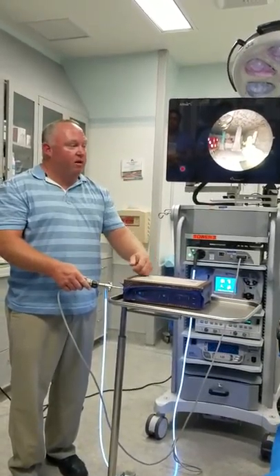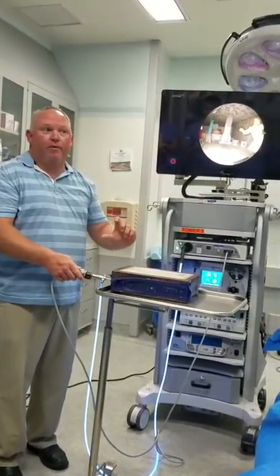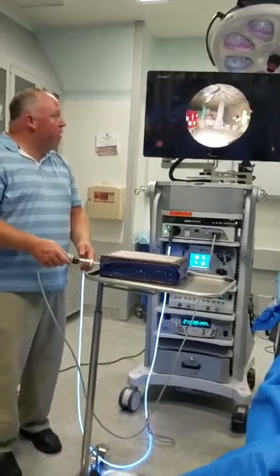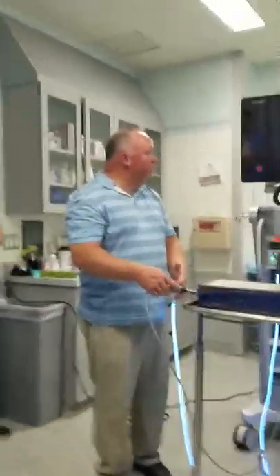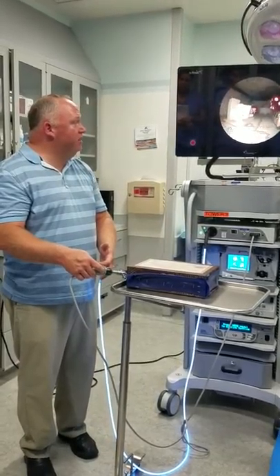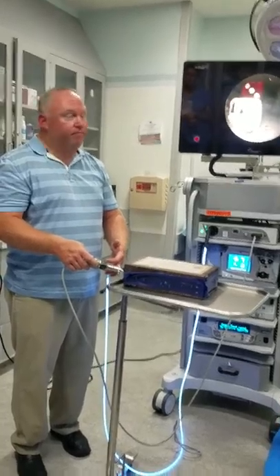And so I'm going to have you look at the dice, and they're going to grab the dice and make it the one up top or the two up top. Oh, cool. And then we can work together. That's what you're doing in the operating room. So when the doctor's working, they may be trying to put a needle in here. I have to hold it very steady while they're doing that. And I'm about to pan out so they can see more, or I'm about to follow the needle where they're going.